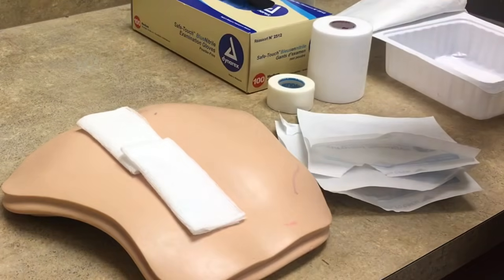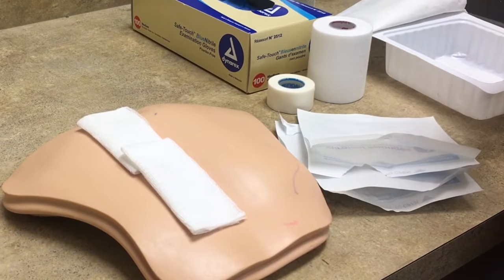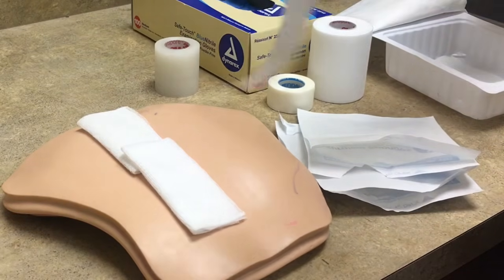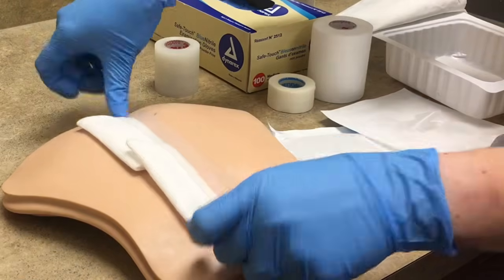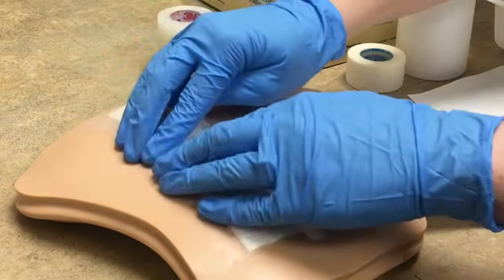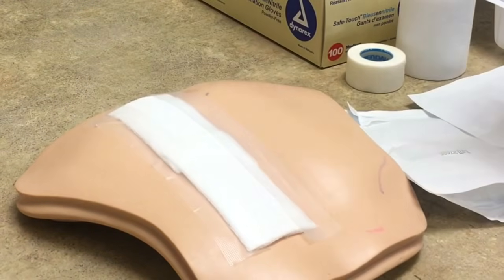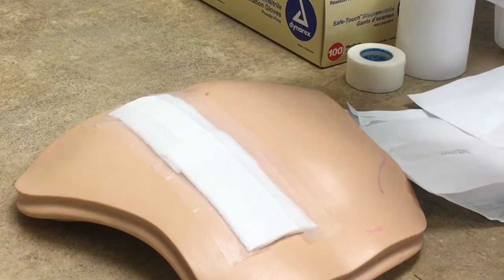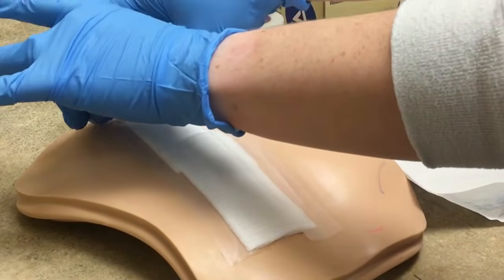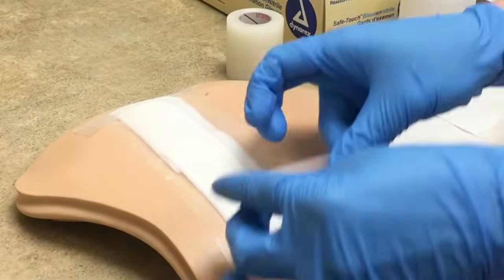As we apply our tape, we are going to remember to only tape 1 inch of the skin touching the tape, because that'll just help decrease any skin irritation. There are certain ways that you can tape a dressing. You can do two long and then two short at the bottom, and that's what Chris is doing for us today. And this will secure your wound and create an occlusive dressing.